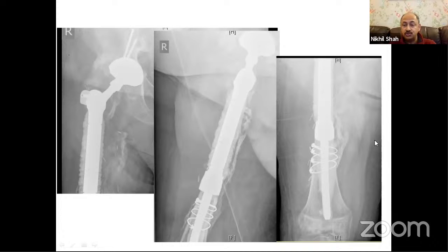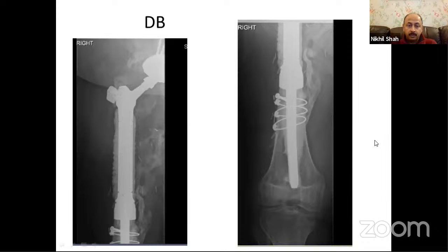So what you tend to do is you leave a sliver of the greater trochanter if you can, and then apply it to the lateral part of the stem on the flare. And then you can put a little plate on it so that you can attach the trochanter with the abductors to the lateral part of the cortex so that you can get relatively good abductor mechanisms. And if you have any doubt, then you have to go for a dual mobility or a capture cup to try and get stability. And that's his follow-up at approximately 3 years.